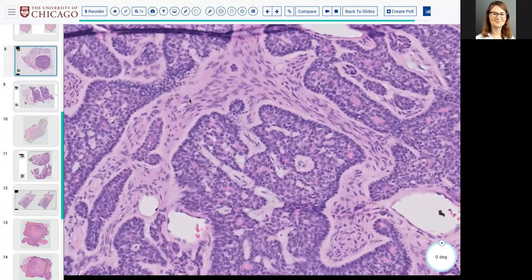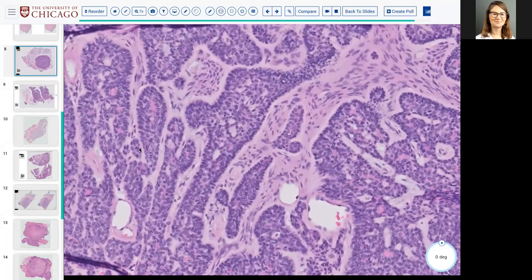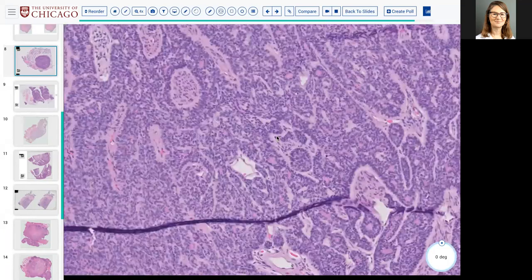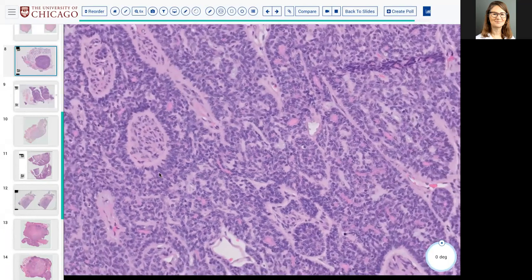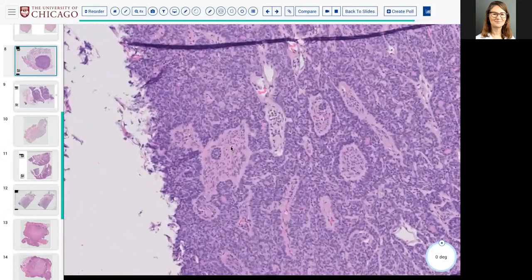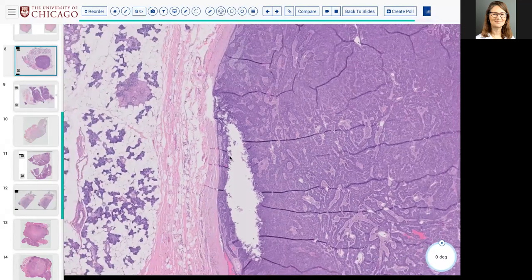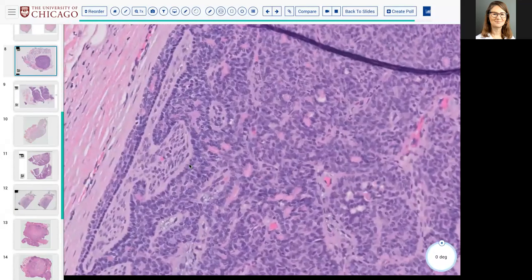These cells are strongly positive for S100, so that can be helpful. Interestingly enough, basal cell adenoma is also a biphasic type of neoplasm. So you should be able to highlight these duct-like areas with c-KIT, and the background palisaded myoepithelial-type cells with P40, P63. Those two stains plus the addition of S100 in this stroma is very nice. What else is very helpful in basal cell adenomas diagnostically? What stain? Beta-catenin.